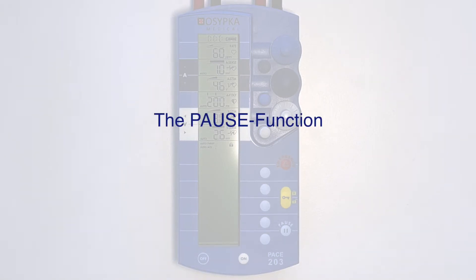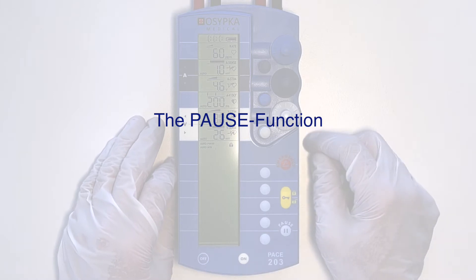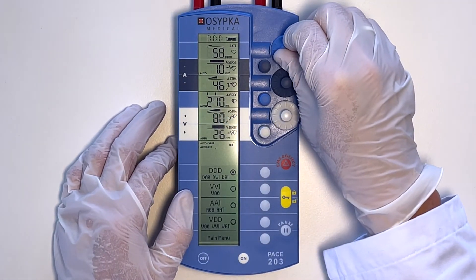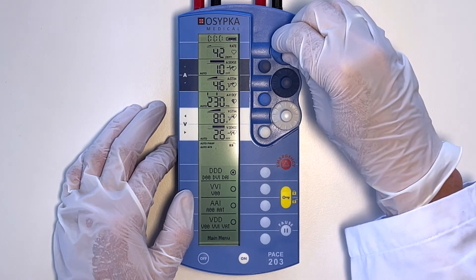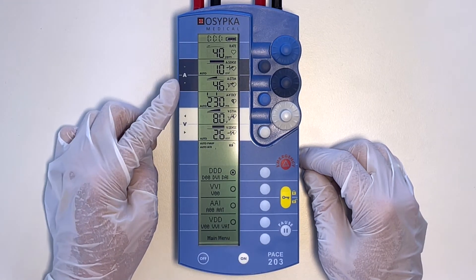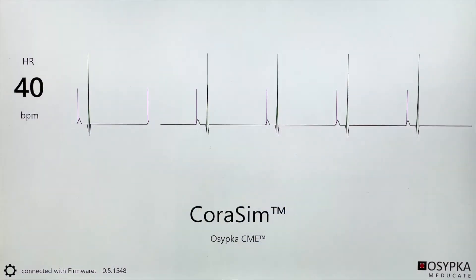In order to check the patient's own rhythm, the stimulation frequency is usually set to a low value, for example 40 pulses per minute. Nevertheless, the heart rate may not get through and the pacemaker continues to stimulate. This can be seen here by the flashing yellow arrows and the ECG pacer spikes.